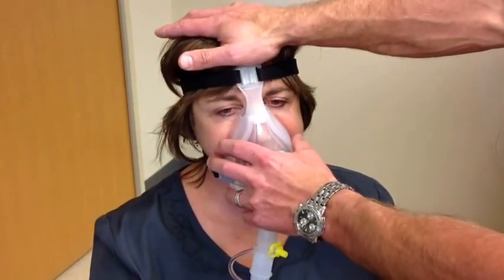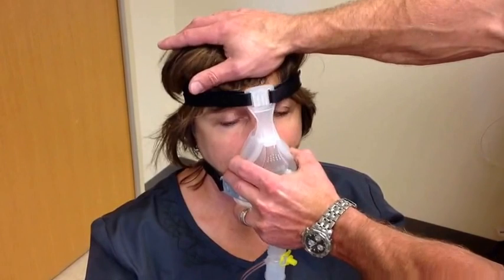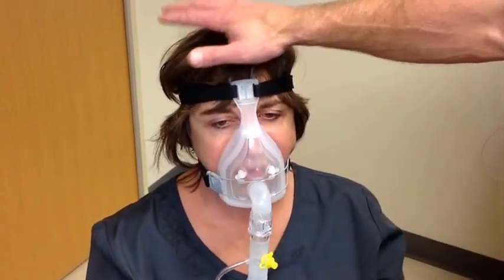corresponding to the leak. One more method of fixing a mask leak is to pull the mask up off the patient's face and gently set it back down again. Sometimes that will seal the leak without making the mask any tighter than it already is.